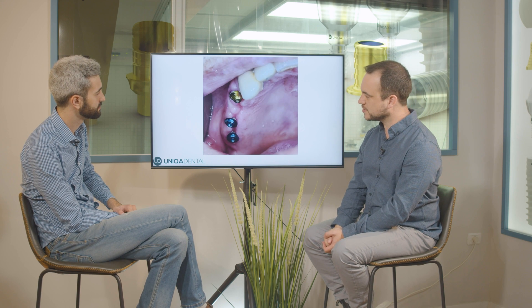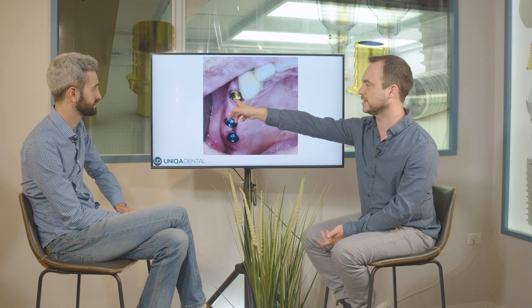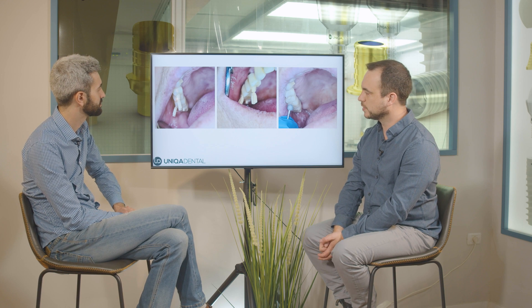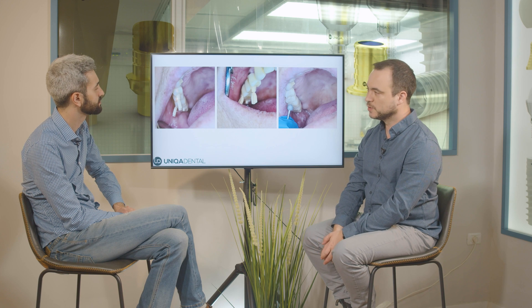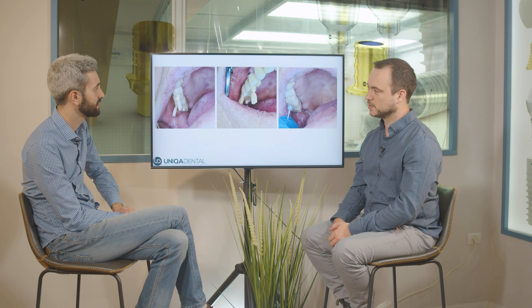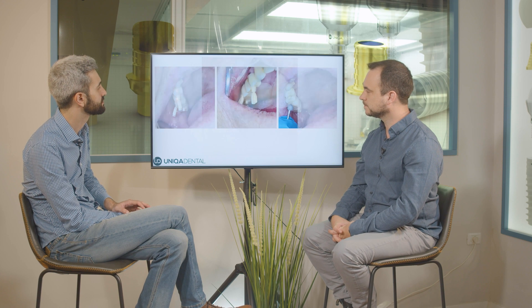This is the V-type sleeve and this one is the D-type. This is the angular D-type sleeve, and those two are the V-type sleeve multi-units. As we said, this is the angular one — angular in this direction. Here we mounted the final restoration. We closed the holes and with a big burr we polished it. Why a big burr rather than a standard one? You have a large contact point, and it's much easier to get a nicely smooth finish with a bigger burr. This is the zirconia — this is the final restoration.